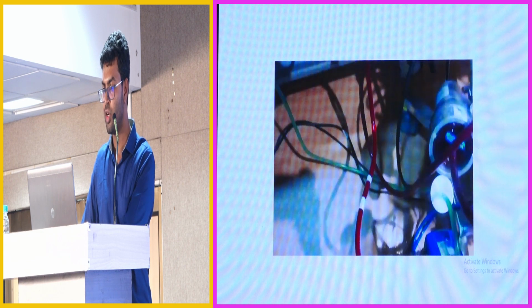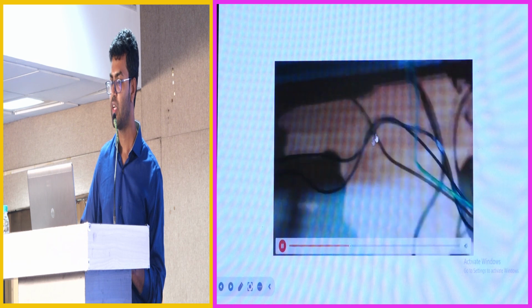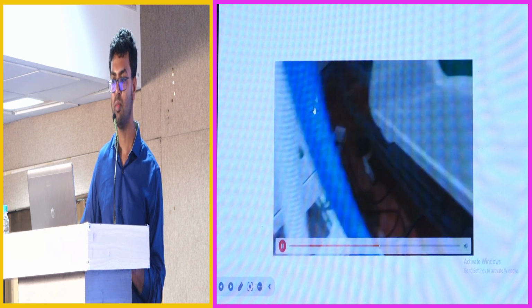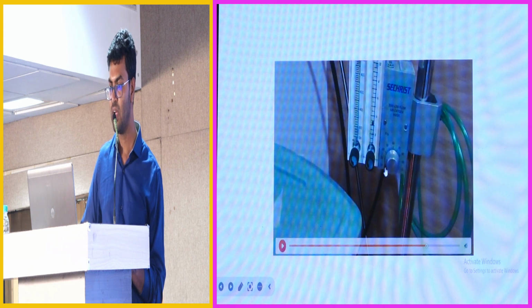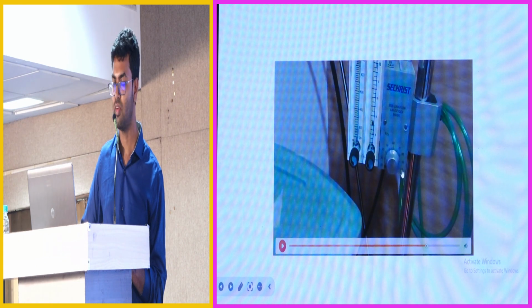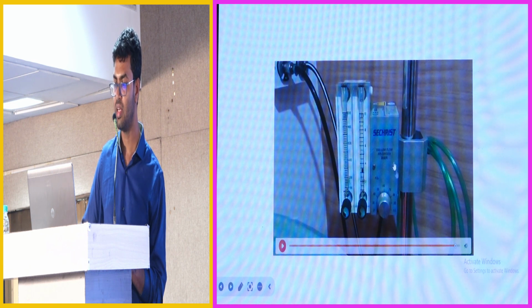I wanted to show you how the oxygen inlet will be. The oxygen inlet will be here. We can take this oxygen from our blender. This is our blender. The blender has a labeling of 0.21 to 1 FiO2, and the amount of sweep gas flow can be managed from here. You can dial it and keep it whatever you want. The blender receives oxygen and air. Here you can maintain the FiO2. Here you can maintain the sweep gas flow.